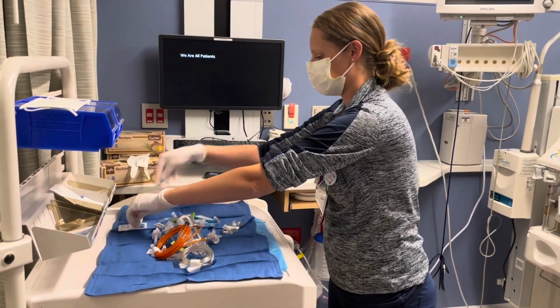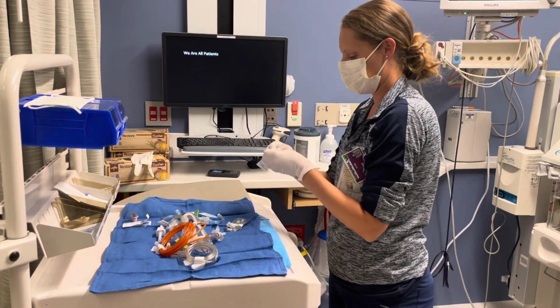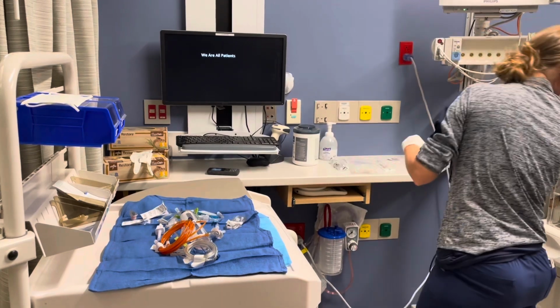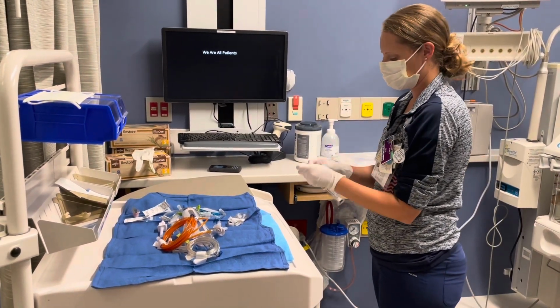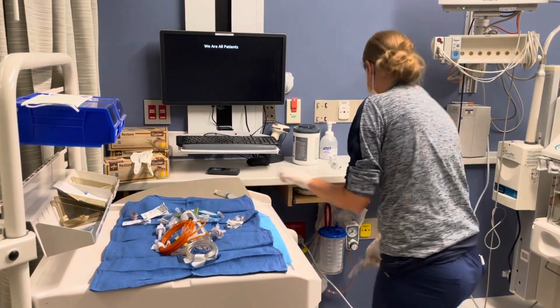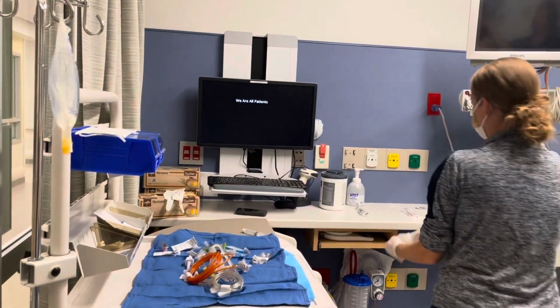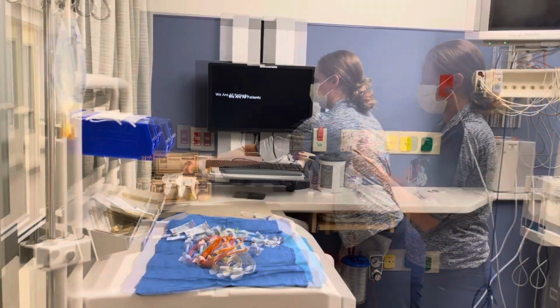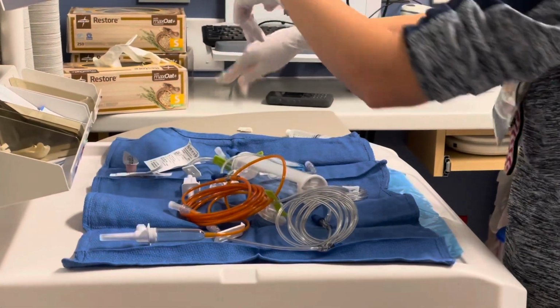Best practice is to connect each IV tubing, extension set, and microclave one at a time. When opening the microclaves, leaving them in their open packages can create one more barrier to potential contamination of any items coming close to the open central line catheter. Central line associated bloodstream infections are most commonly caused by a breach in standard aseptic precautions when accessing the catheter. This includes IV fluid and tubing changes.